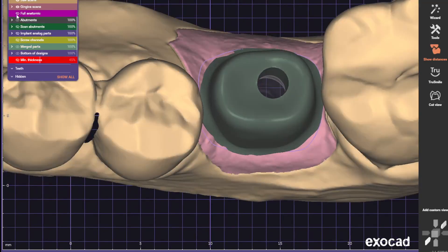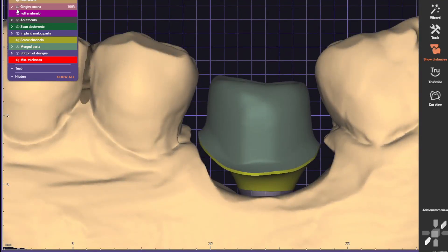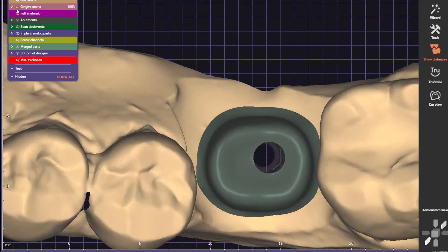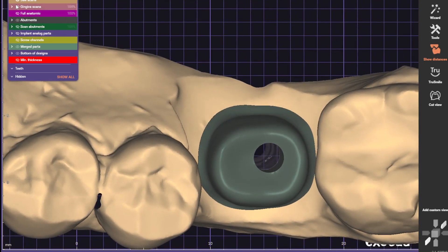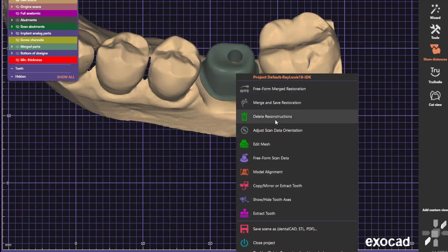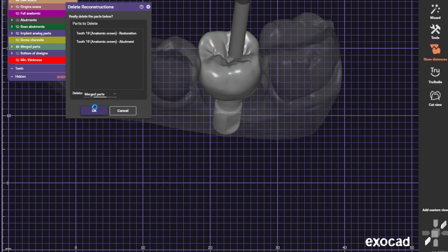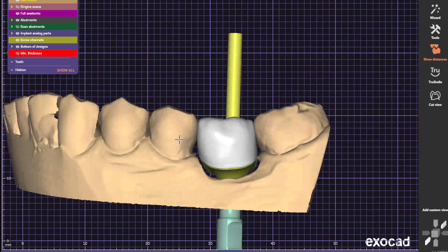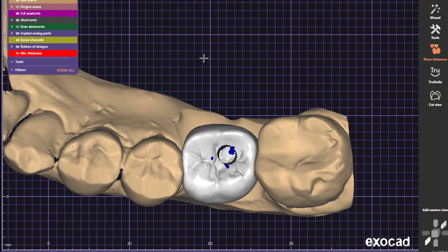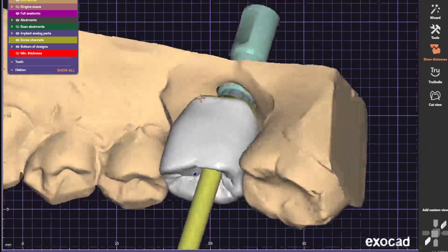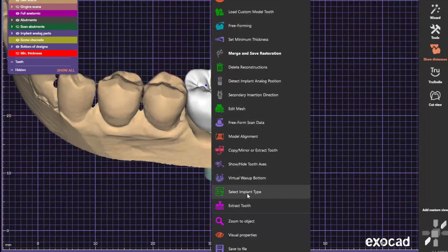But we're gonna change this to screw retained anyway, so I just wanted to let you know what our preferences are. Let's go ahead and we'll get started. We're gonna get rid of these merged parts. Crown design looks pretty nice. Let's go ahead and change this to screw retained.